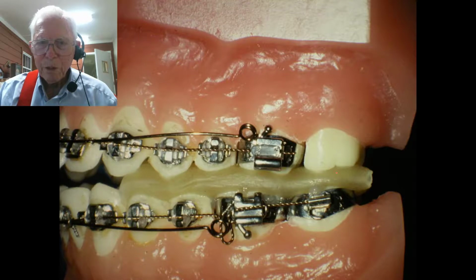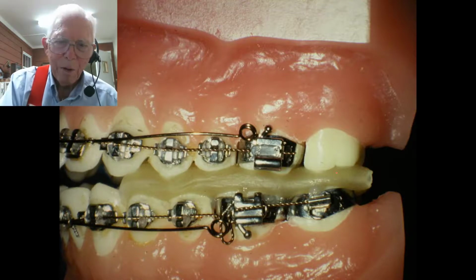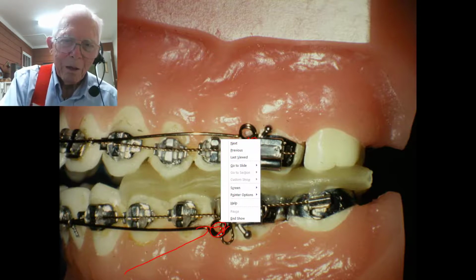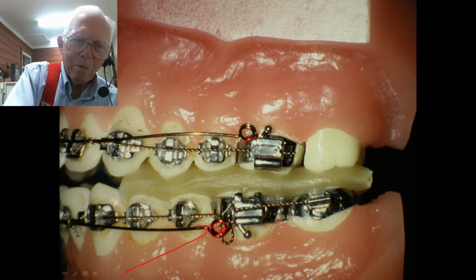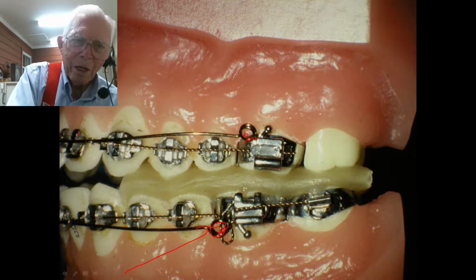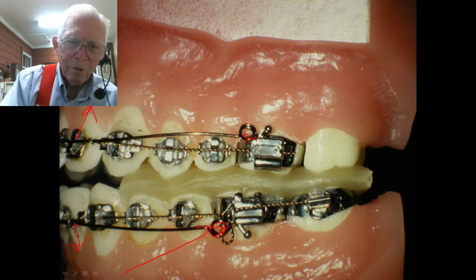Now, this particular case, we're doing an open bite, and we've got this intruding arch wire. It would come off like this. You see, this comes out of here, and it comes in, and now it will go up like this. And when we squeeze it down, it tightens this loop, and it'll pick these teeth up in the front, but in here, it has almost no effect on these teeth back here because the occlusion keeps it.